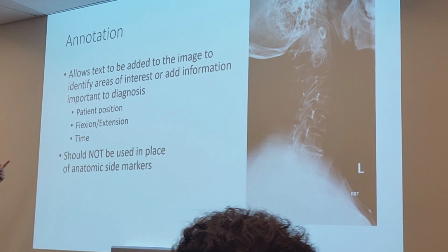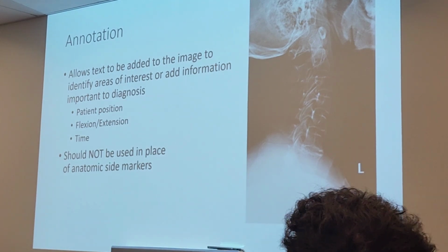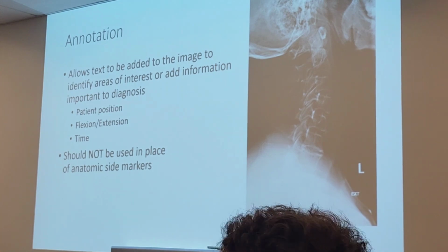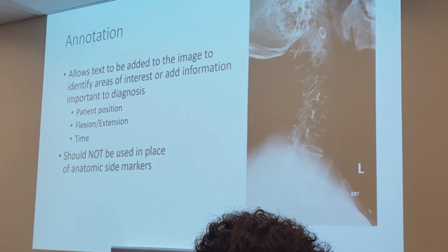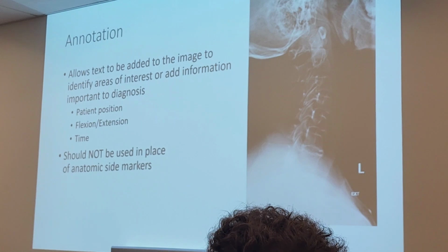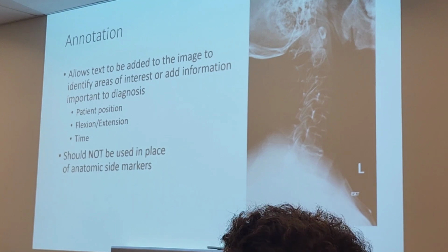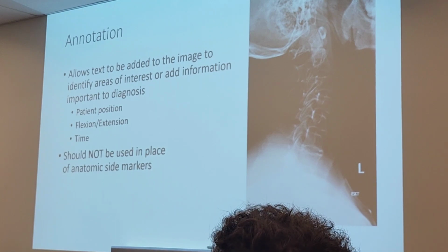Notating the position, right? Annotations for patient position. You can use it to annotate supine, upright, weight bearing, semi-erect, decubitus, left decube, right decube, flexion, extension. For example, if you do a small bowel follow through, right?